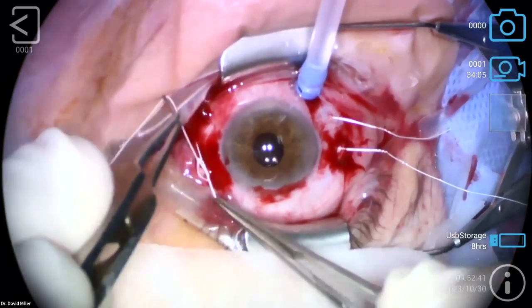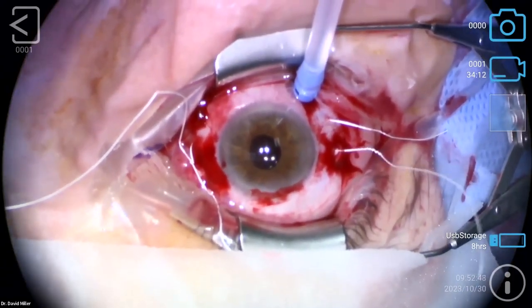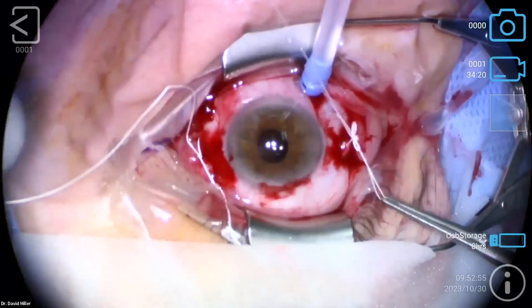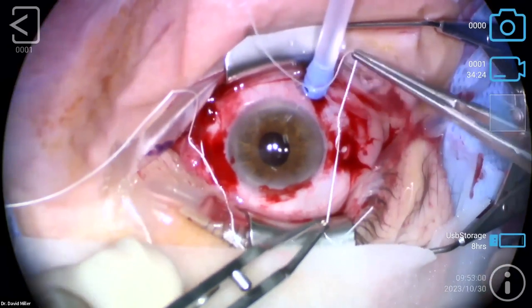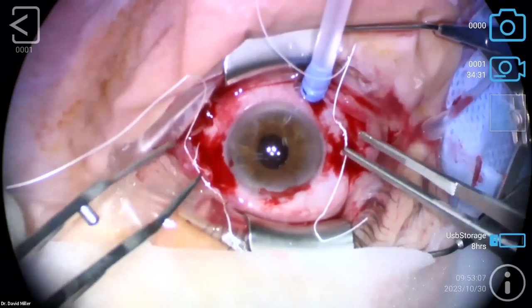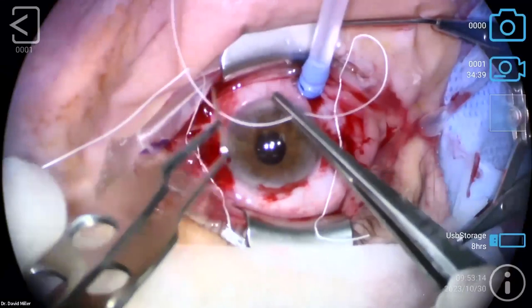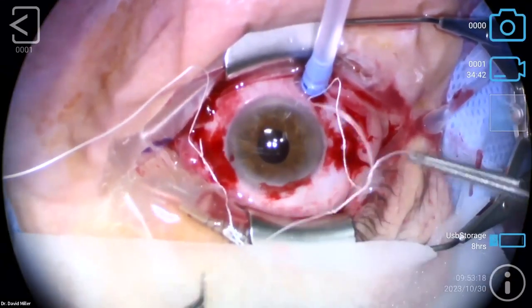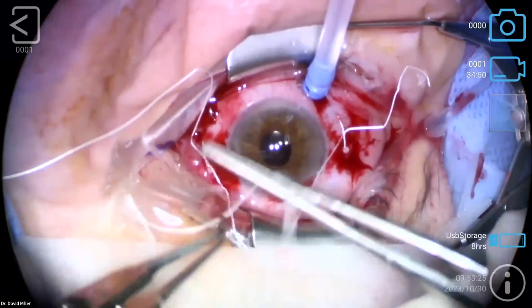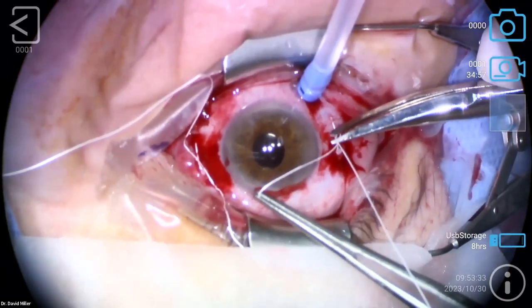So we put this knot down. Now, before we cut that, we'll tie this one. Just a 3-1-1 knot, and you can see that come across there very nicely. Before I tie, I don't want anything tight. I just want it suspended. The lens won't move, it won't shake in the eye, no optical problems like that. Looks pretty well centered. I'm just going to put that one down. He's going to cut that. You can leave little tails on these. There you go.